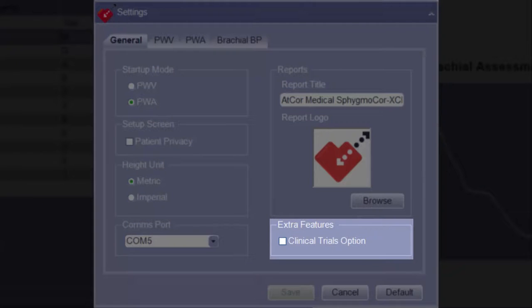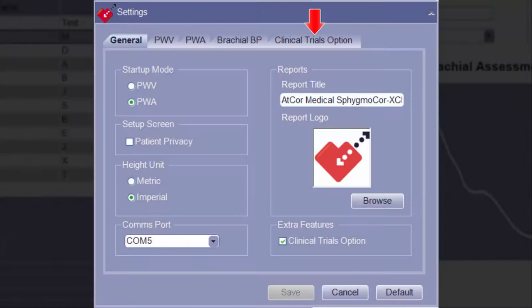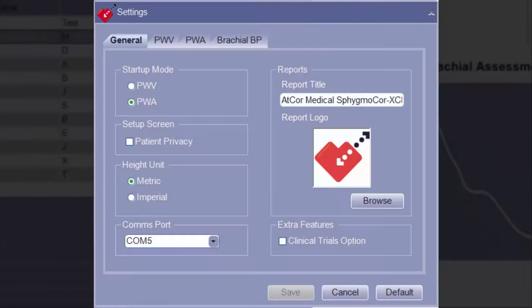In the Extra Features section, the Clinical Trials option can be enabled or disabled by checking or unchecking the box. When enabled, a new tab with additional settings is displayed. These settings will be discussed later in the video. To return any settings back to the default values on any tab, click the Default button in the lower right of the window.